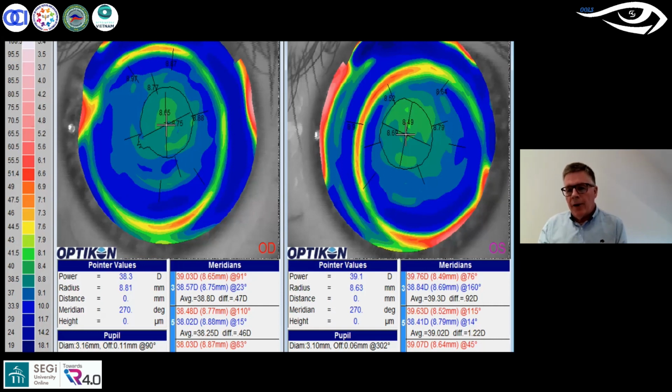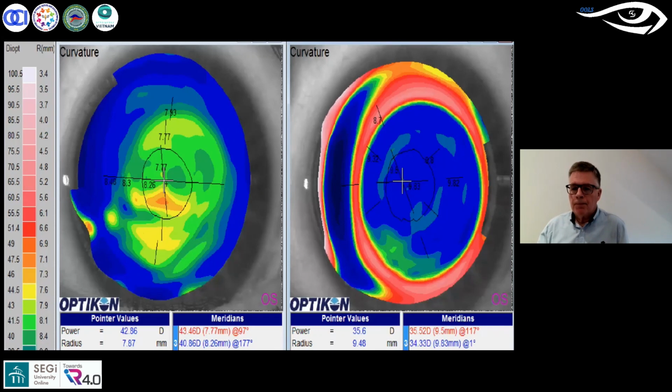Now, again, on a spherical contact lens, this may not matter too much, but if we were fitting lenses in multifocal form, or for that matter, and much more importantly, if this was a myopia control lens with concentric optic zones, this would be a very, very important factor to take into consideration. So this is a very, very valuable tool in our regular non-hospital environments.